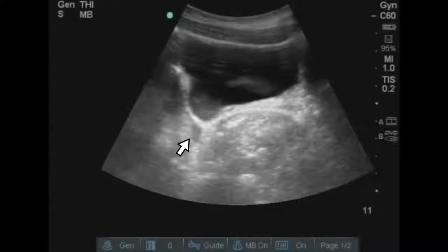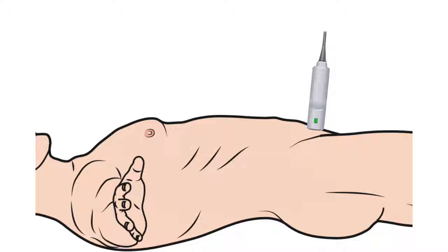This shows the presence of free fluid in the posterior field. You can see some free fluid deep to the bladder, anechoic with sharp angles. However, the posterior acoustic enhancement has not been accommodated for and far field gain has not been decreased, making that anechoic area appear to have echoes within it. You can also note there are echoes within the bladder showing that it is slightly overgained. To compensate for this, you would have to decrease far field gain to make that fluid appear anechoic.